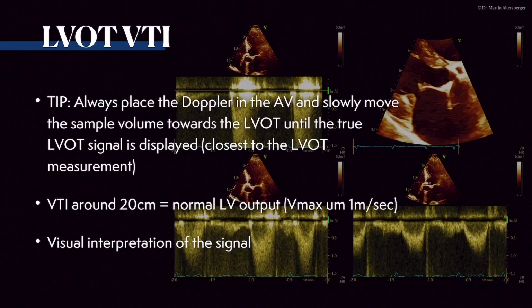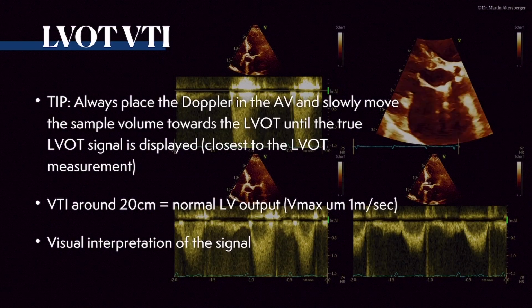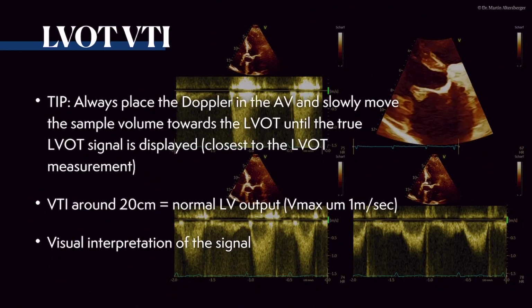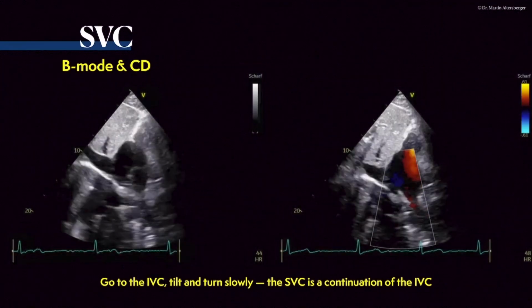Of course, a visual interpretation of the signal in the acute setting also helps, so you should still be used to those measurements. So simply repeat and measure so that you also feel more comfortable with the visual assessment as well. The SVC, we talked about it briefly.